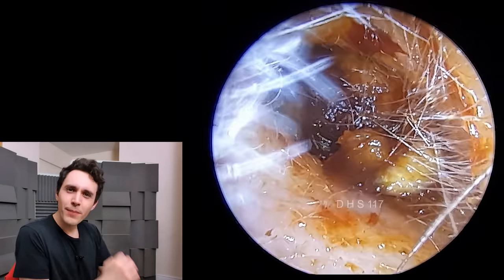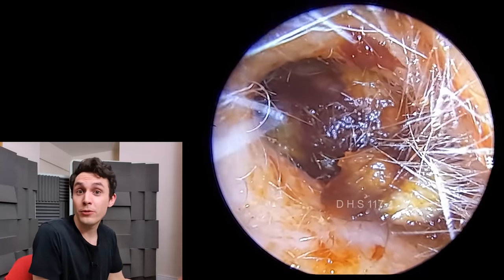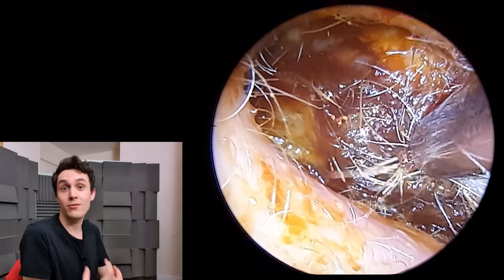Hey everyone, it's Connor here and welcome back to another very interesting video. It's a video where I'm using a new endoscope camera, which I'll talk about in a moment. If you like the look of this footage, let me know what you think in the comment section below. I'd be really interested to get your thoughts.